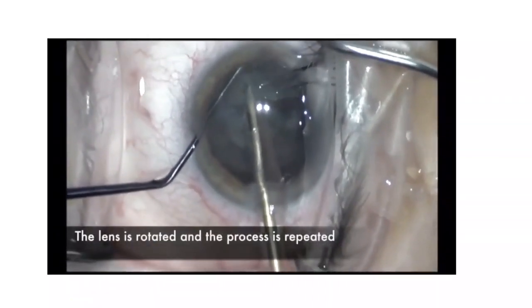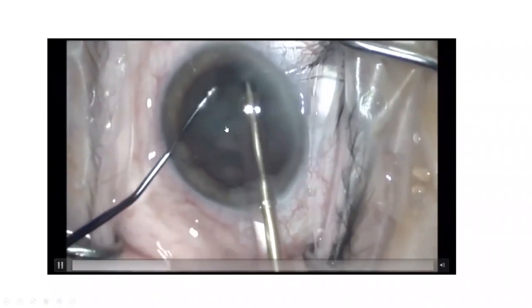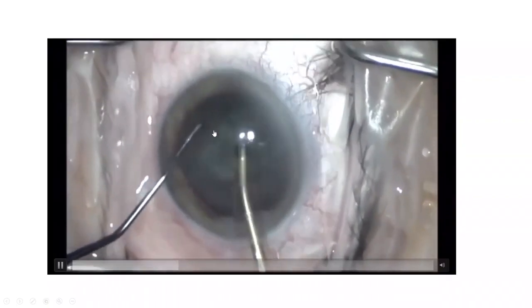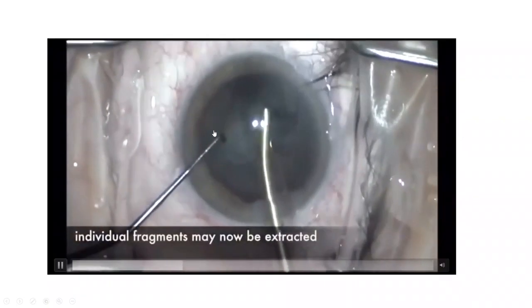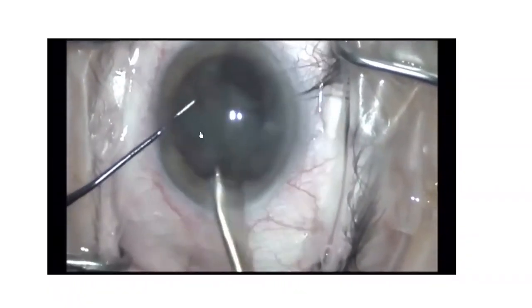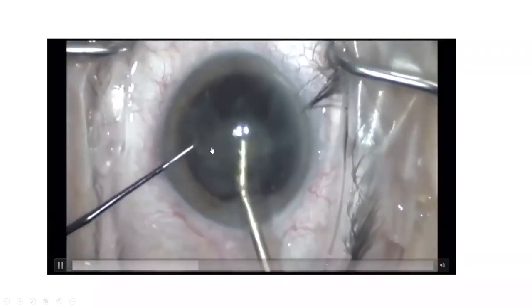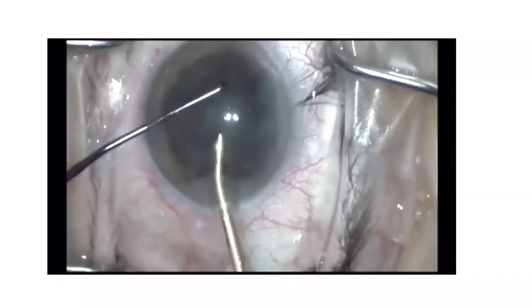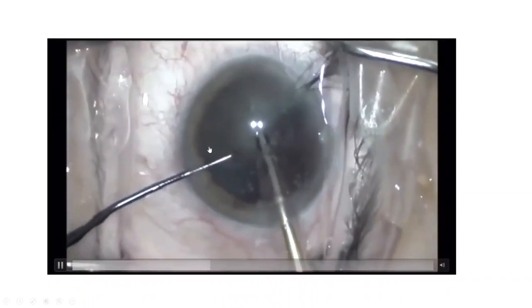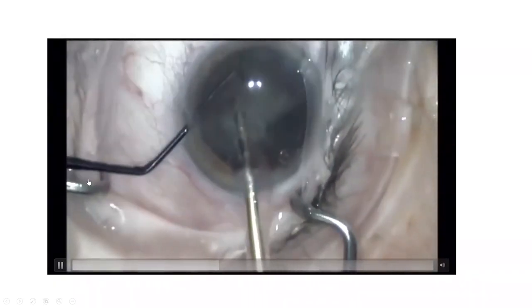Here you need to be very careful because you are close to the capsule edge. So this is the disadvantage of this technique: if you are not experienced enough, you may harm the anterior capsule. You may cause a tear to the edge of the capsule. So if you are starting chopping, you should start first with a blunt or ball-tipped chopper, a chopper with a ball tip, to be gentle on the capsule.